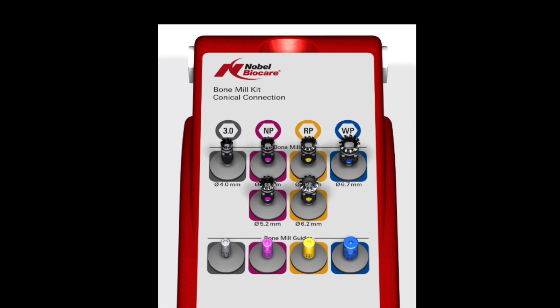The kit itself comes in four different platforms with different sizes of bone mills for each platform. For instance, on the regular platform we're going to be using the 5.2 bone mill, which will mill just a little bit wider than what we need — we need to have an emergence profile that's going to be about five millimeters. Using the regular platform 5.2 is going to allow us to seat the abutment down properly at the time of prosthetics and even at the time of doing the temporary, which we're going to do today.